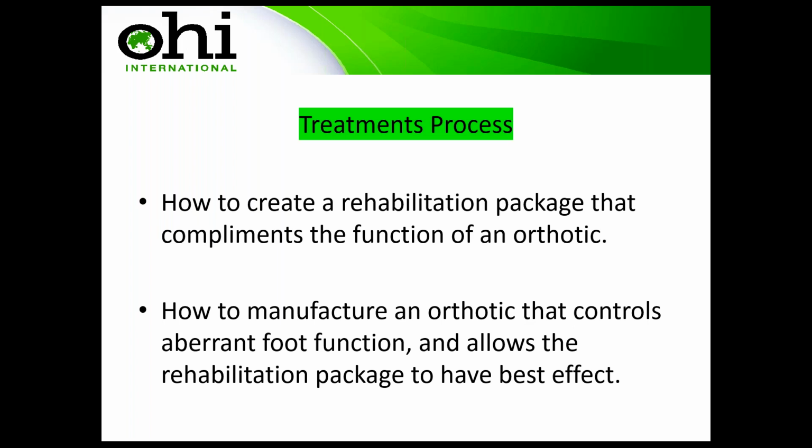Don't use it as a tool for saying everybody who walks into my practice needs an orthotic. But everybody that walks into your practice, you're sitting with a really high-tech piece of kit which can give a really good aid to diagnosis and can help direct a patient to more directed rehabilitation. And we want that rehabilitation to complement the function of an orthotic if they do then go down the route of an orthotic.